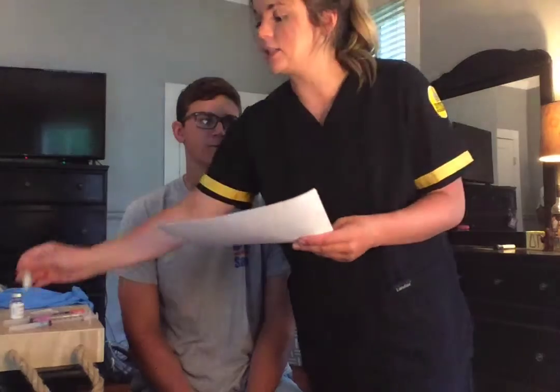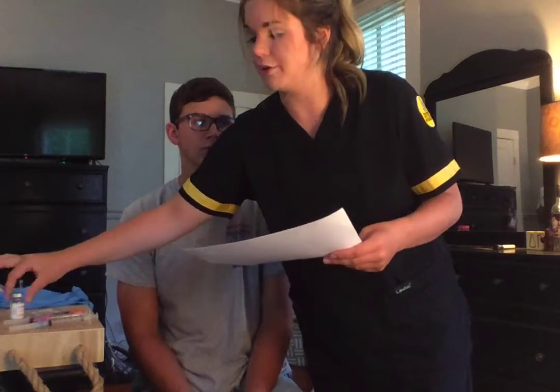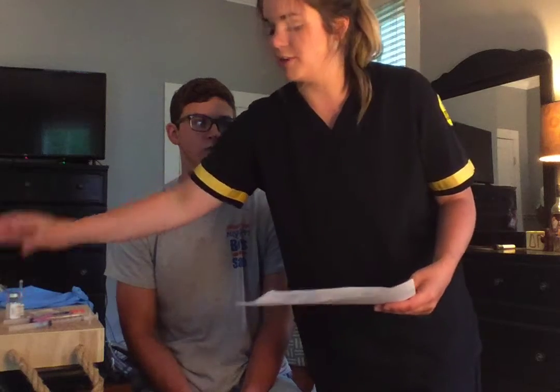It looks like today we're going to be giving you insulin and ondansetron, and I've already double-checked them twice in the MAR, so I'm going to double-check them for a third time with my MIR. So this is the insulin, and it looks like we have the right one, insulin. This is your Zofran or ondansetron, and we have the right one. So perfect, we can get started.